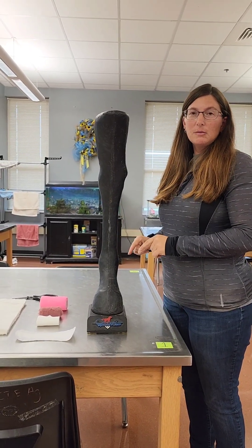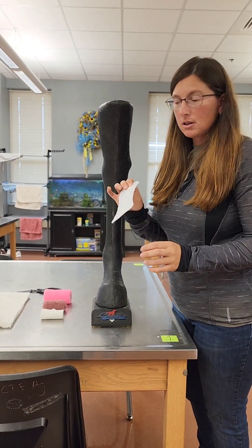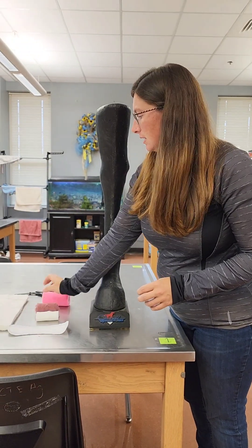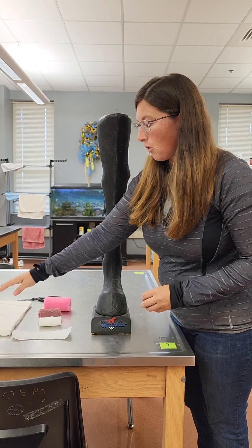We're going to apply a lower leg bandage to a horse. The materials that we need are dressing or sterile gauze, roll gauze, brown gauze, vet wrap, and sheet cotton — sometimes called a cotton roll.